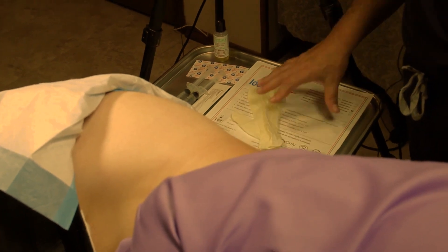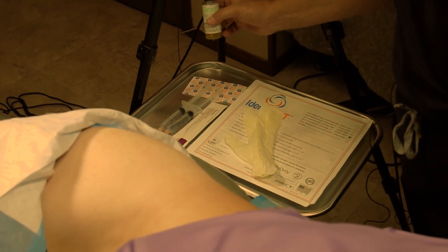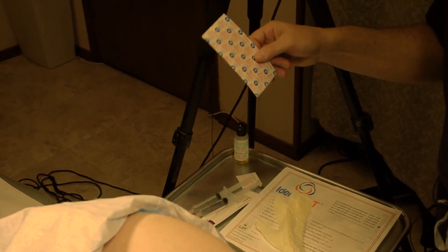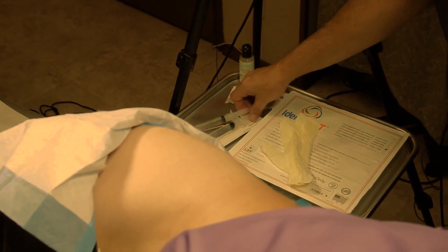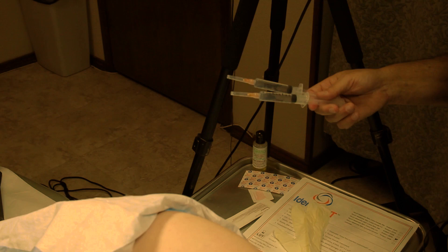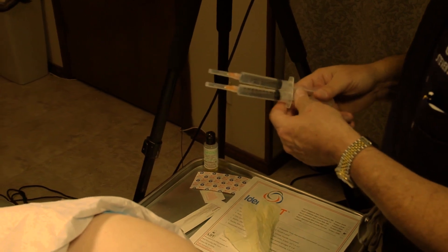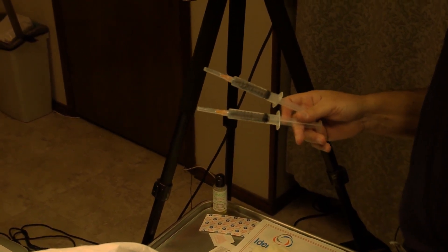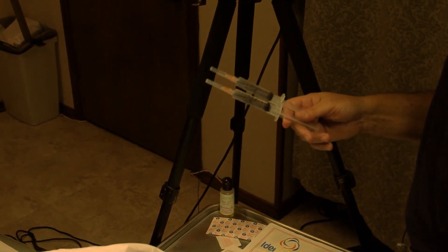Besides the pellet tray, some other things that we'll have ready is obviously a Mayo tray, some Mastisol to use for the Steri-Strips, and a large Band-Aid that we buy in volume — the same type you might put on a scraped knee. We have two syringes of injectable anesthetic prepared earlier this morning. In each syringe, we have six cc's of one percent lidocaine plain, three cc's of lidocaine with epinephrine, and one cc of buffering bicarbonate. Unlike female patients, with the male patient we may have to use as much as two syringes.